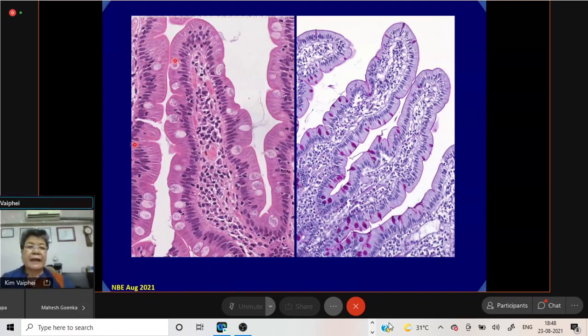And in a normal mucosa like here, the goblet cells are very uniformly distributed, and the enterocytes are seen very well. There are no degenerative changes; these are intact enterocytes. Here one could see the brush border, which is highlighted much better on the PAS stain. Brush borders are not light microscopy features; these are electron microscopy features. This is God's way of increasing the absorptive surface. God has given us the folds, God has given us the villi, God has given us the microvilli.